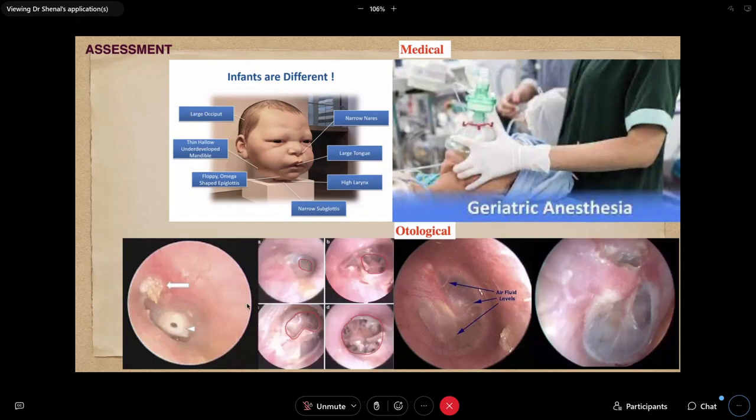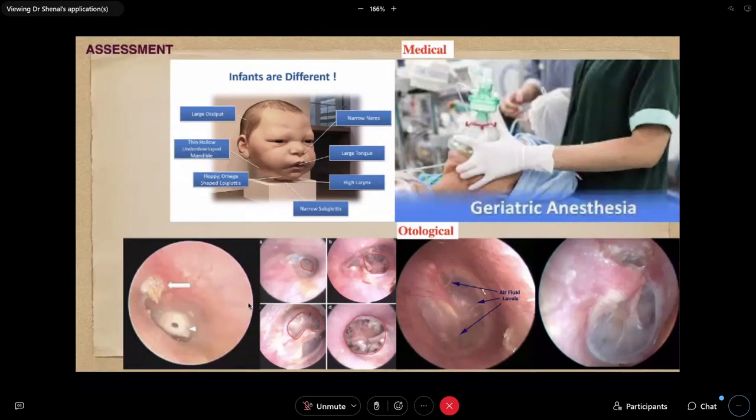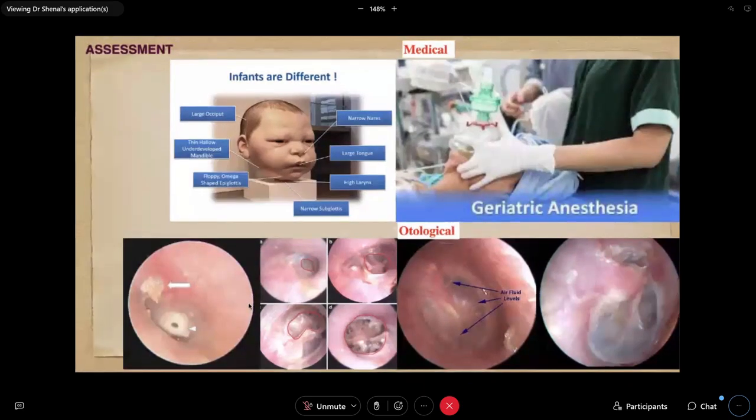Sometimes patients may have an MRM already done. In such cases, we need to do a blind sac closure. You need to obliterate the cavity along with the implant. So that is how it works. So the barrier has to be there.